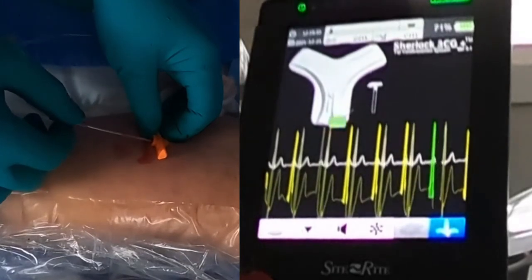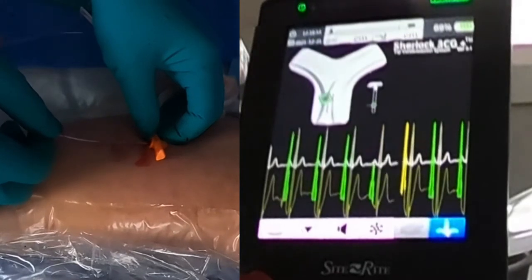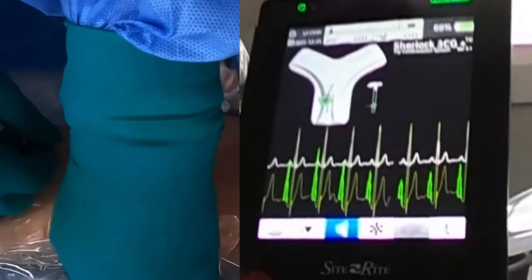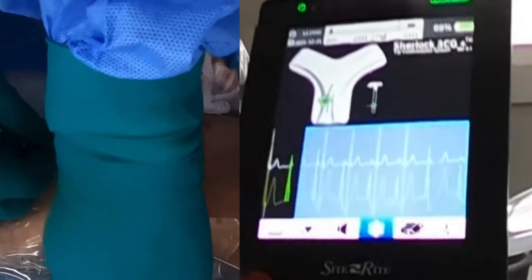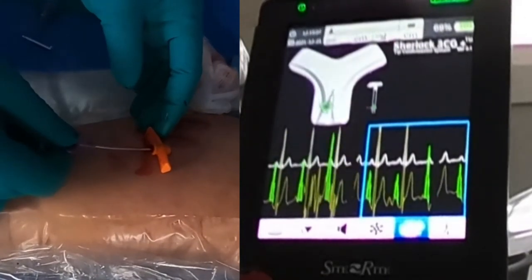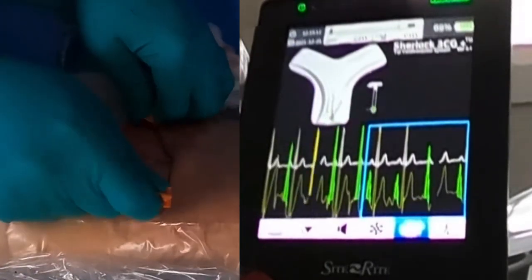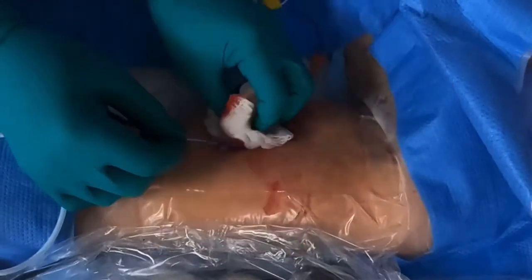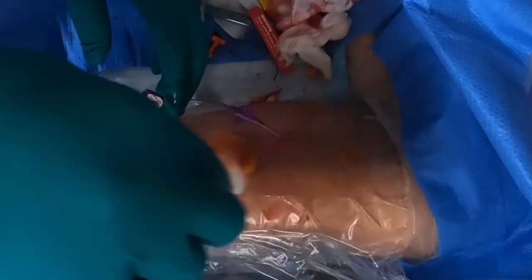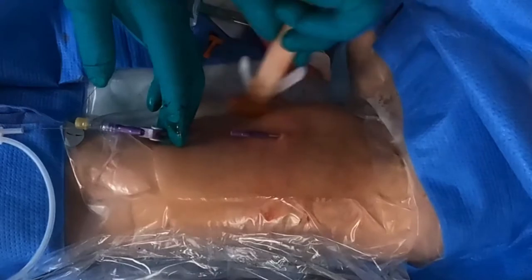Still inverted — pull back another. So I'm at about five centimeters now. I'm going to pull back at five centimeters, so we're going to cut at the five. I'm going to freeze that so I have it on record. I'll have about three in — we're good. So we're pulling three for the secure cath, that way he can move around more freely. Just cleaning the blood — that's it.